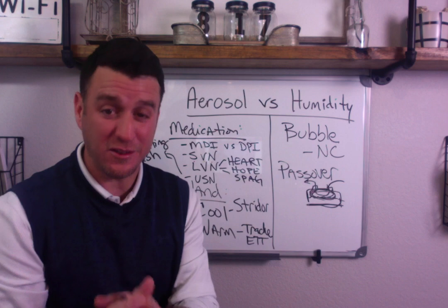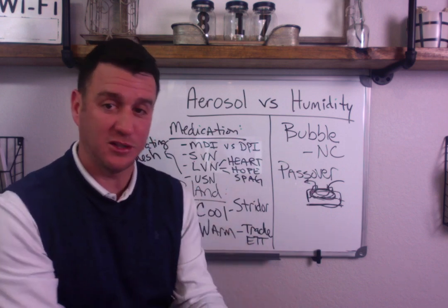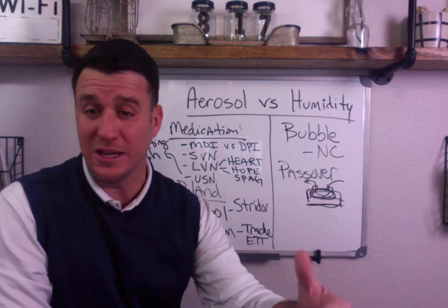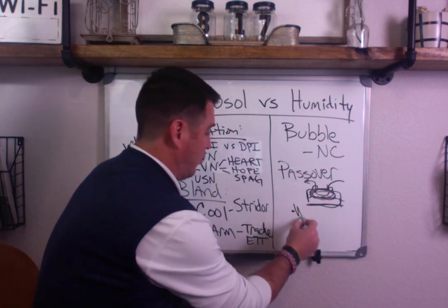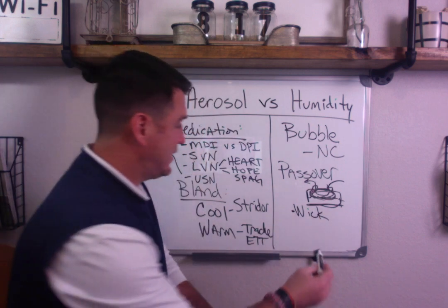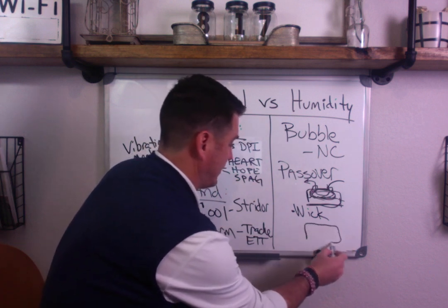Okay, now there's another type of passover that provides even more humidity. So if you want to maximize humidity, let's say you're taking your TMC exam and it says which of the following will maximize humidity delivered to your patient, then this device called the wick is another type of passover humidifier. But what it does is it looks like this. I'm going to simplify this drawing.